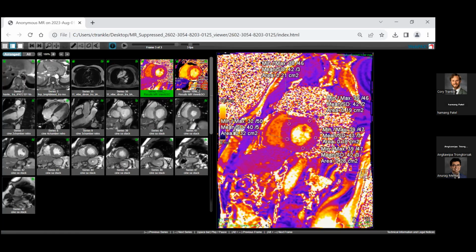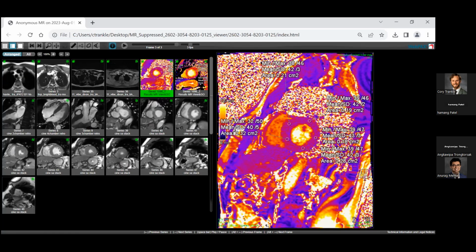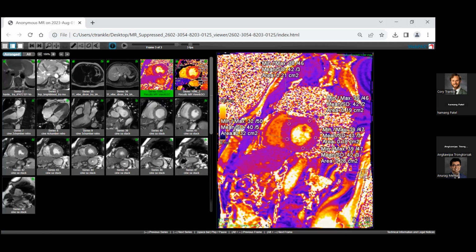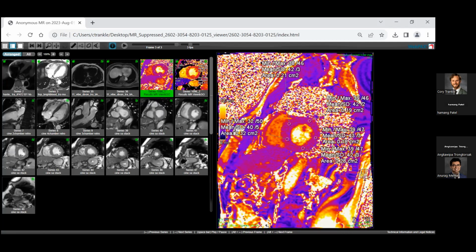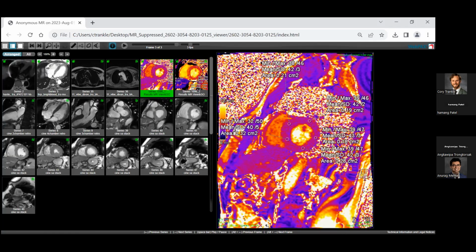I could not distinguish the 20 shades of black. It was just insane. So I'm thinking it's probably more the 80 to 100 from brightest white to black. There's just not an ability for me to see some of those 400 shades of gray.